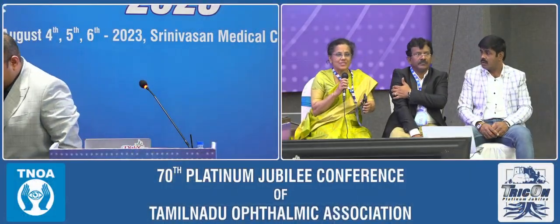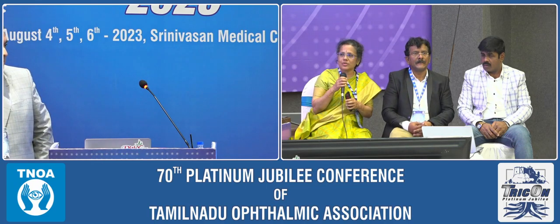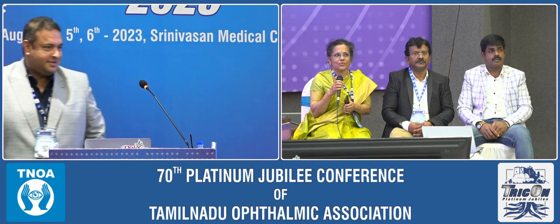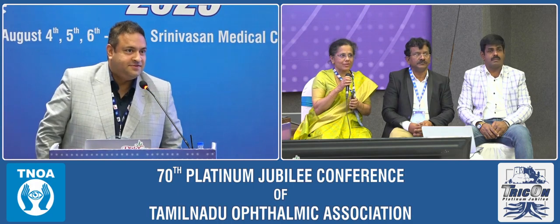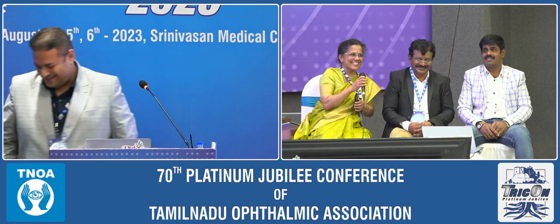Thank you, Dr. Sridhar, for the excellent videos. And if you noticed, he went beautifully along the arc of the capsule to remove the cortex. So that is the secret of doing a complete cortical removal.